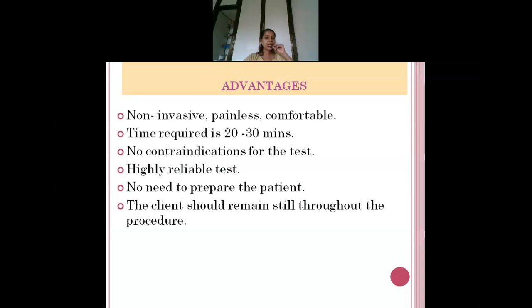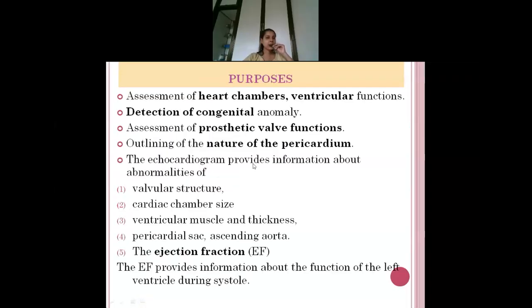Next is, it is highly reliable. If the person who is doing the scanning knows how to read it well, then it is quite reliable. Okay, and much preparation is also not required before the procedure. You need not do some emergency pre-procedure things. Immediately if you need to do echocardiogram, shift them to the ultrasound room. Then one more important thing is, tell the patient to remain still while they are doing the ultrasound of the heart.